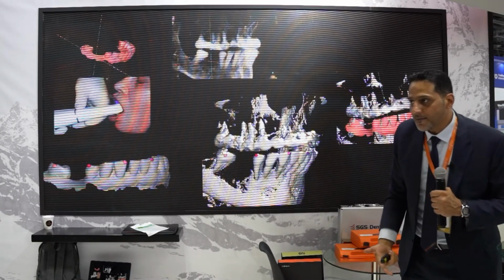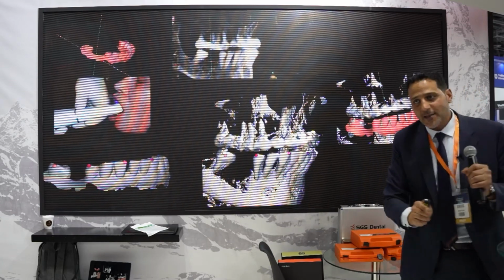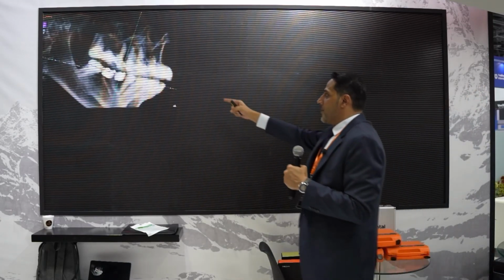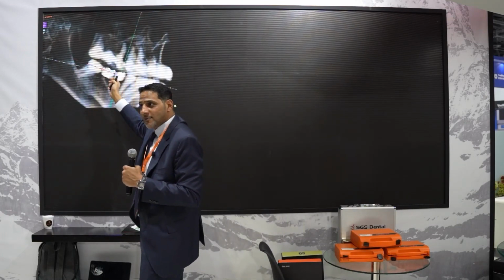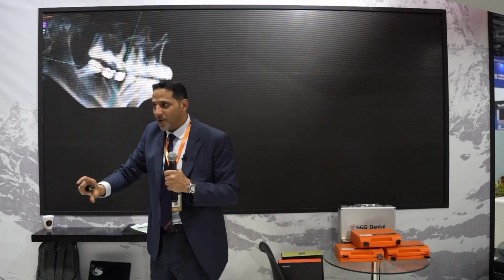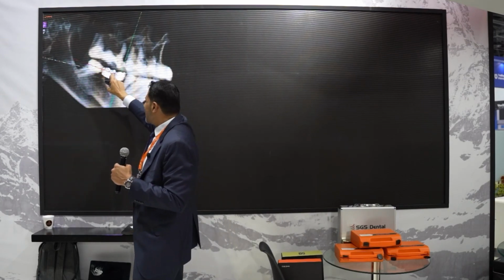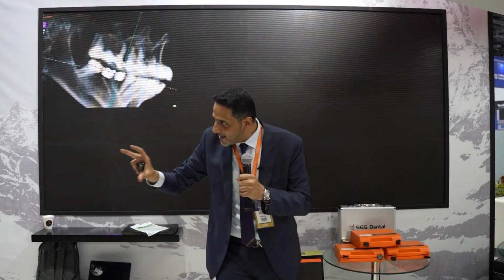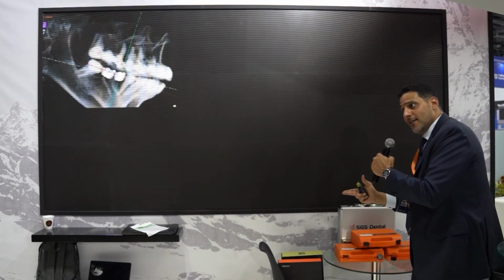So what is next? Plan. We have to plan it. Okay? We select from the library crowns. We have a digital wax up. We don't need the conventional one. We need a premolar and molar. So this is my position. This is where I want the crown. Okay, and it is prosthetically driven.